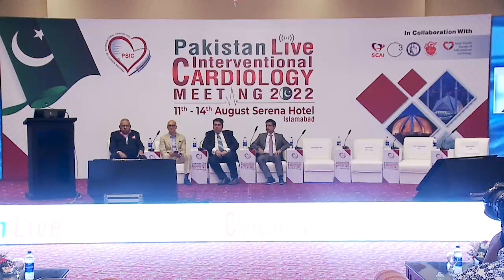And the TAVR valves have continued to evolve. This is the Edwards series of valves from the original Cribier-Edwards design on the left to the SAPIEN 3, which we are currently using in America. And of course, Medtronic has had a whole series of self-expanding prostheses as well, with excellent randomized controlled data supporting their use. So these are the two main valves that are being used in America now and around the world.